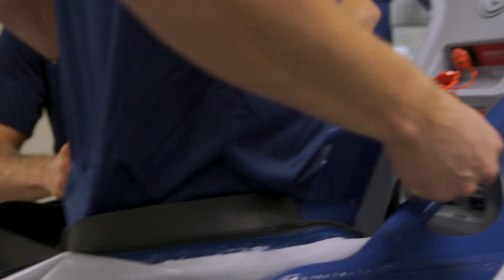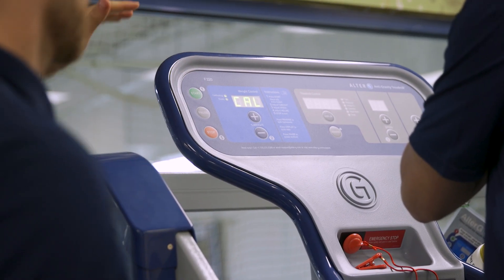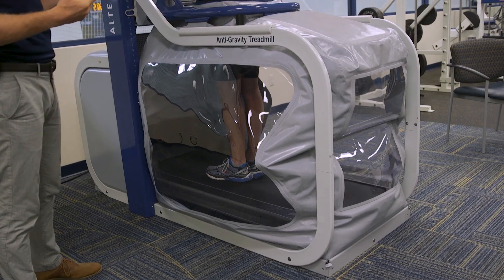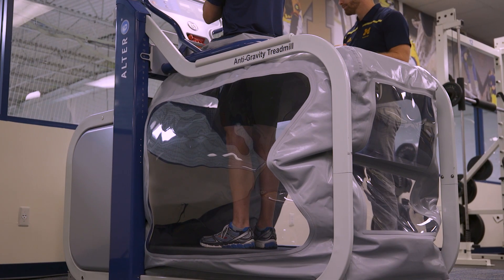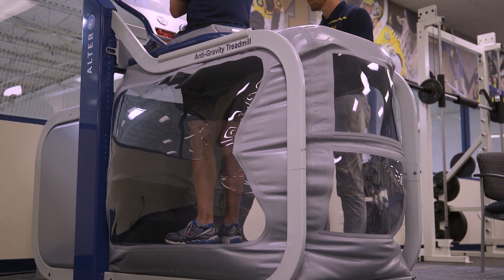We zipper the shorts right into the cockpit, so it's pretty easy to do. Then I'm going to turn the unit on. The unit has to calibrate and start to inflate, basically taking the patient's body weight, so that when we adjust the percent body weight we're working at, it's doing it as accurately as possible.